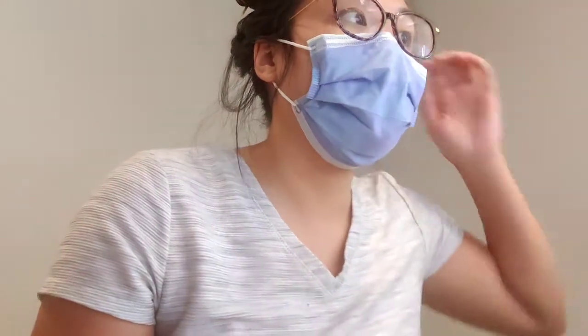For post-processing 3D image of the CTA, which pitch would provide images with the highest quality? Answer, I got this right, 1.